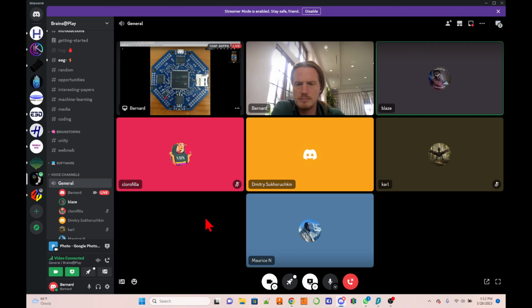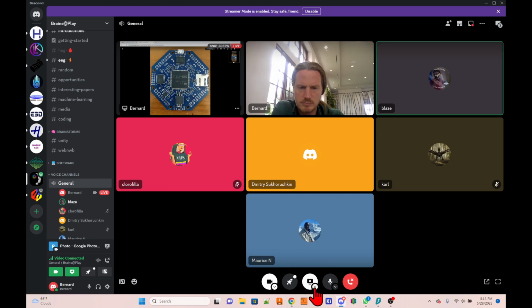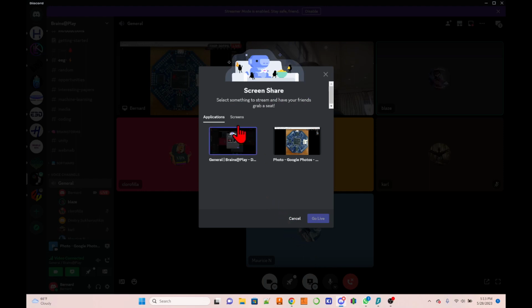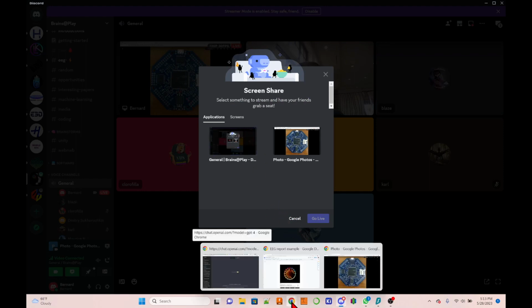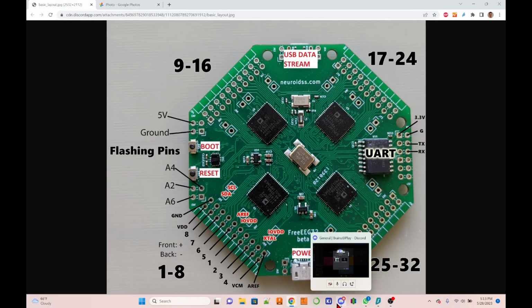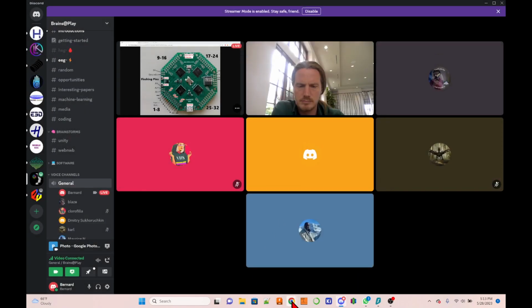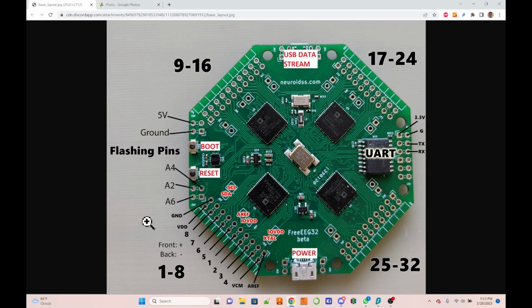Okay, so if I jump all the negatives I want to the ref, then the ref pin on all 4 amps are going to be linked together, so I can then jump on a different set of channels and get the same. Yes, it will interconnect on any of the 20 pins on the 2 connectors. INREFs are interconnected, and they are also interconnected when you are stacking boards. VCM interconnecting, INREF interconnecting, ground interconnecting.